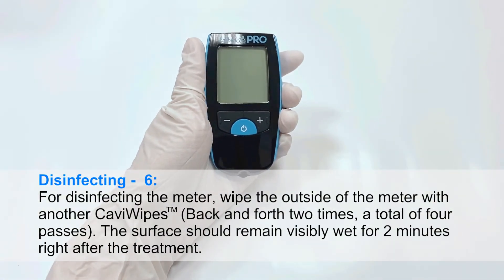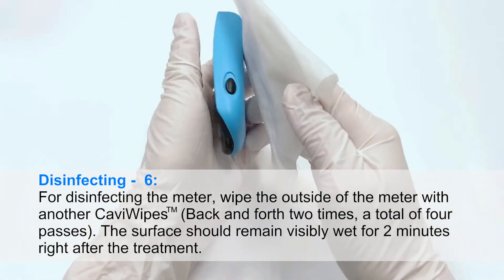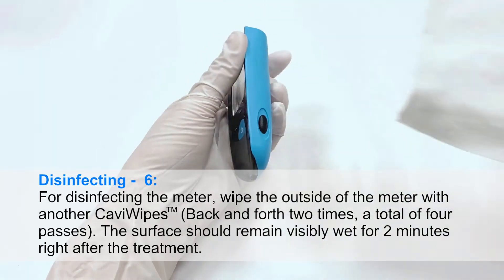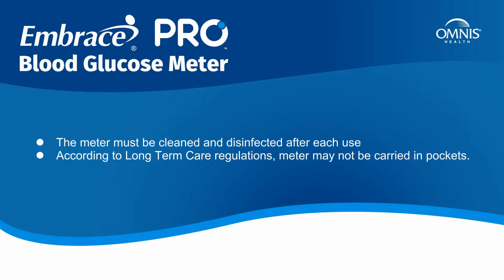Disinfecting. Step 6: Wipe the outside of the meter with another CaviWipe, back and forth two times — a total of four passes. The surface should remain visibly wet for two minutes right after the treatment. Step 7: Throw out used wipes and gloves, and wash your hands thoroughly with soap and water before proceeding to the next patient. The meter must be cleaned and disinfected after each use.